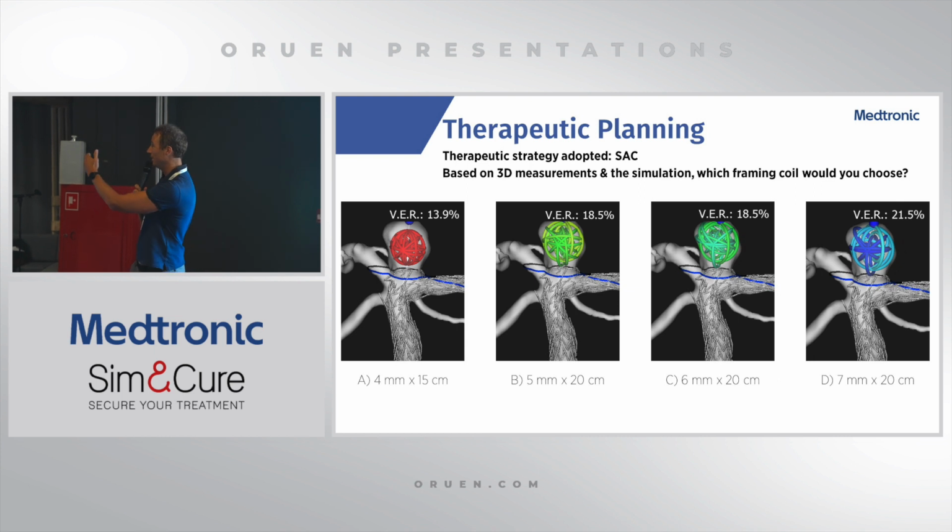And you see almost 92% of them are making the same choice compared to the previous survey. This tool has been used for about 20 years now, but you see that you can still optimize and streamline your decision making just by viewing what you will do before doing it, okay?